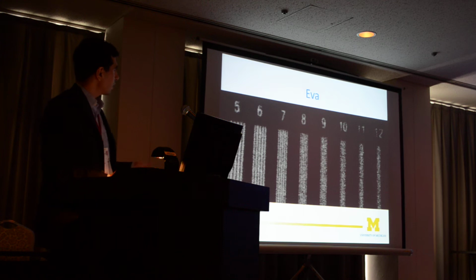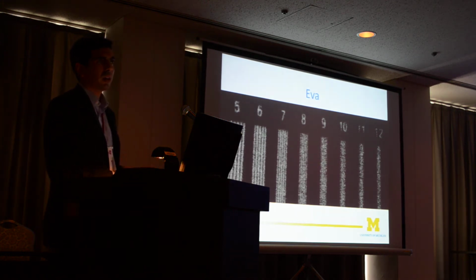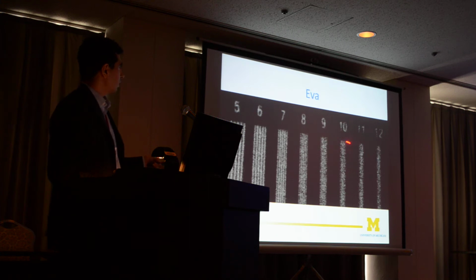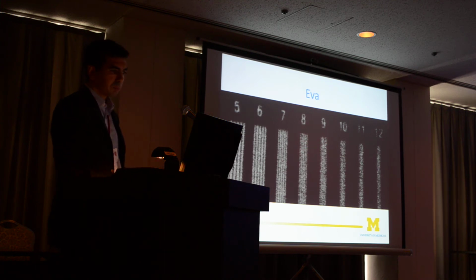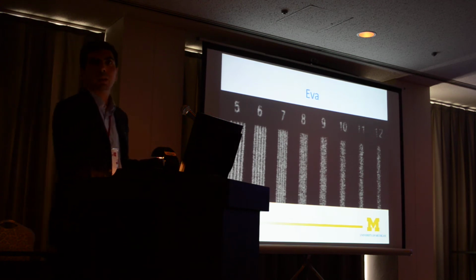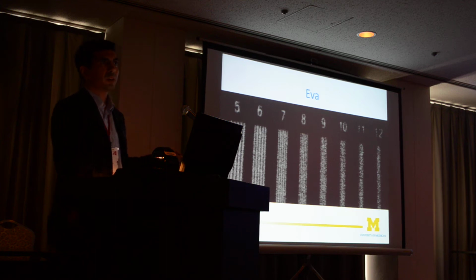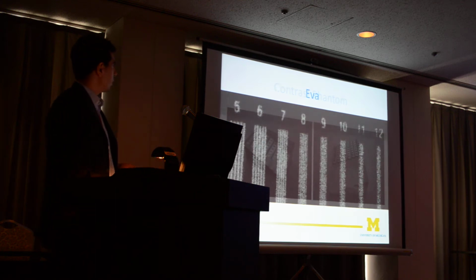The EVA sensor from ImageWorks performed the worst among the sensors, and it has a very hard time getting line pairs above 8 or 9. Unfortunately, line pairs are very important when doing endodontic treatment, and our endo residents used to use this sensor. They were wondering why the image quality looked bad.